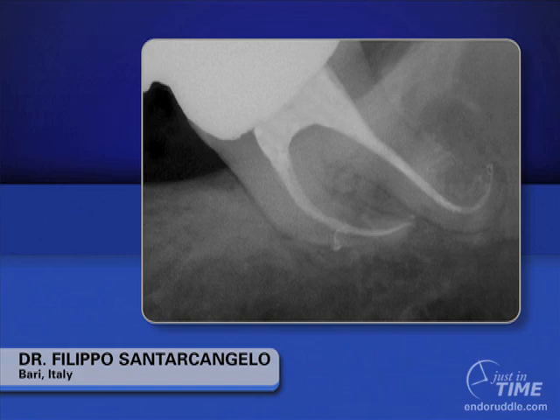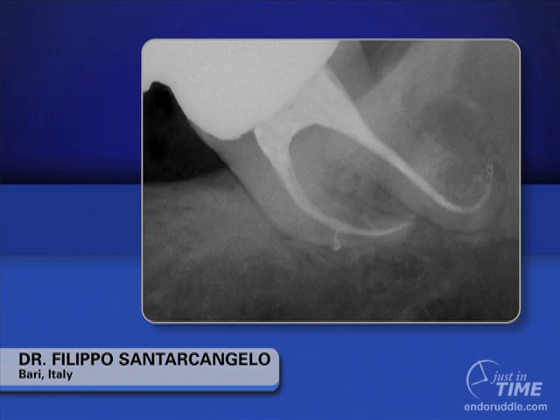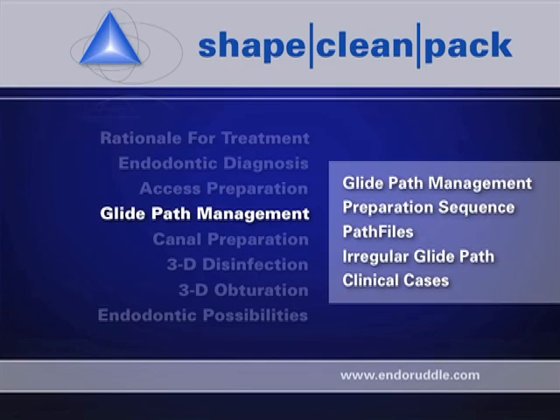Filippo has hands of magic — he is the Leonardo da Vinci of Italy. Notice the curvature in the mesial root, which is pretty significant in the middle one-third, but notice the apical one-third of the distal root — that's more than 90 degrees. Again, the loose 10 was required to get to the three path files, then three path files to get to ProTaper. Notice the shapes are conducive to disinfection, and disinfected canals cleaned three-dimensionally are conducive to filling root canal systems. The secret is access and glide path.